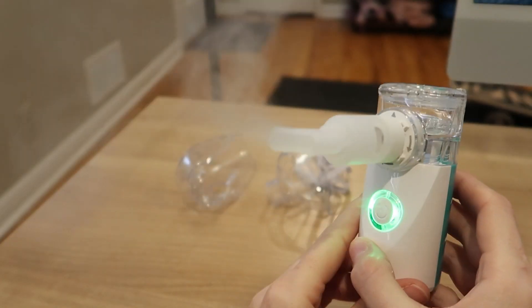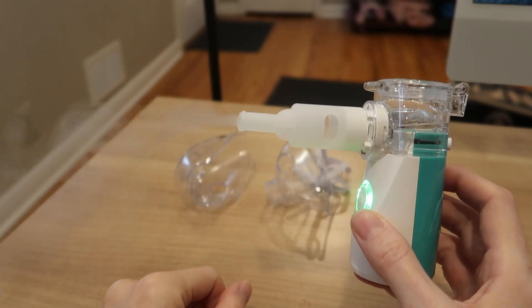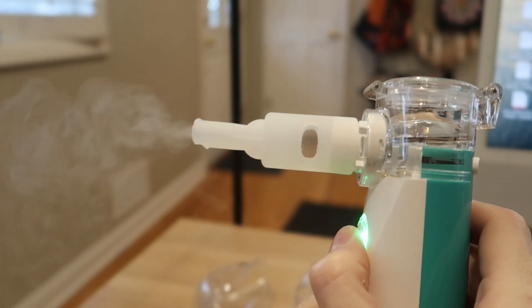You can adjust it to three speeds: from strong mode, nebulizing 0.25 milliliters per minute, which is best for adults, to slow mode, nebulizing 0.15 milliliters per minute and offering better absorption for children.